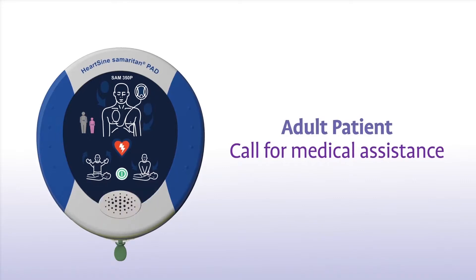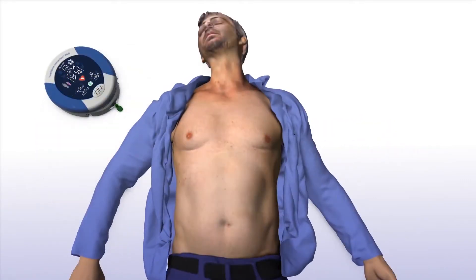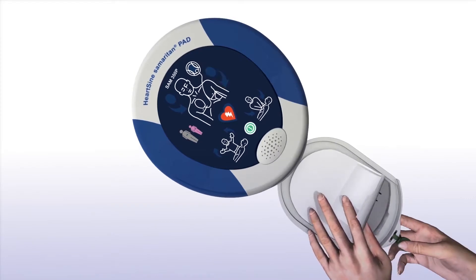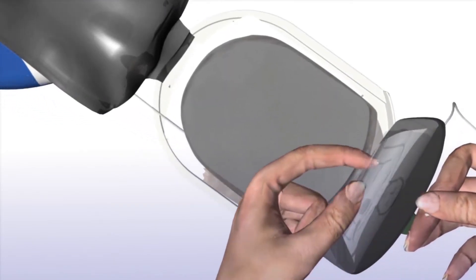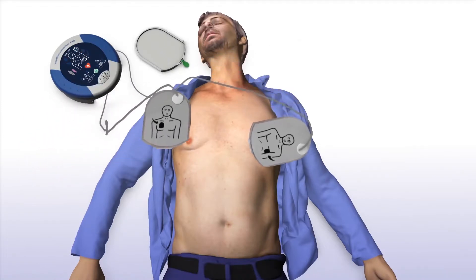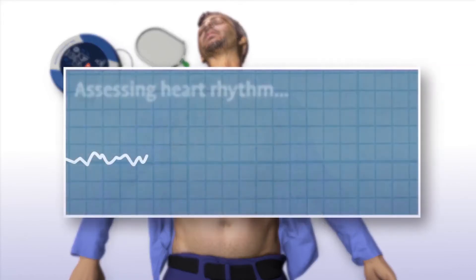Call for medical assistance and remove clothing from the patient's chest to expose bare skin. Pull the green tab to remove the pads, peel pads from the liner, and apply pads to the patient's bare chest as shown in the picture. Press pads firmly to the patient's bare skin.